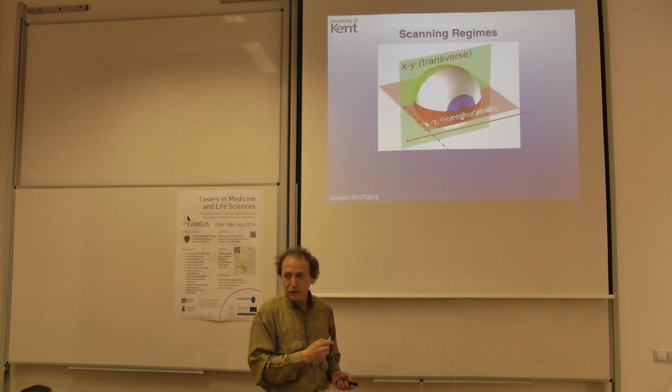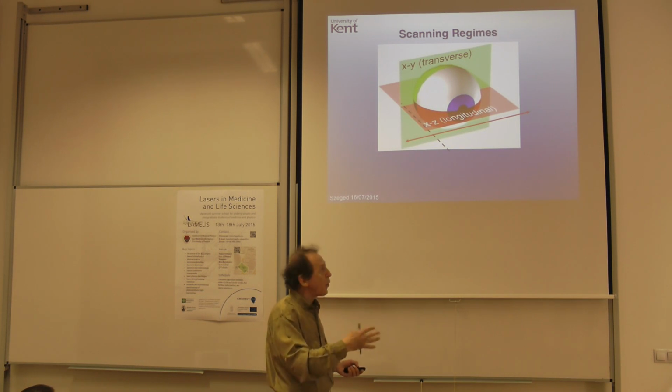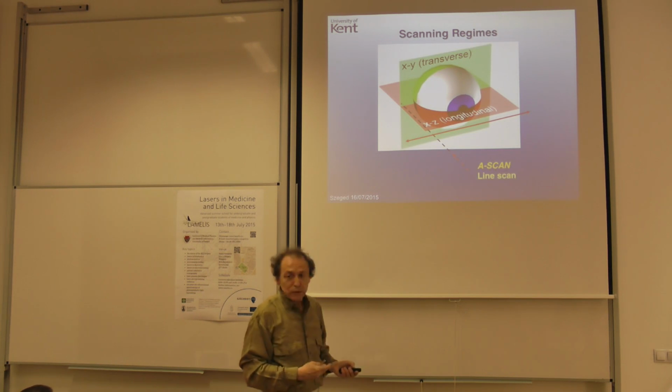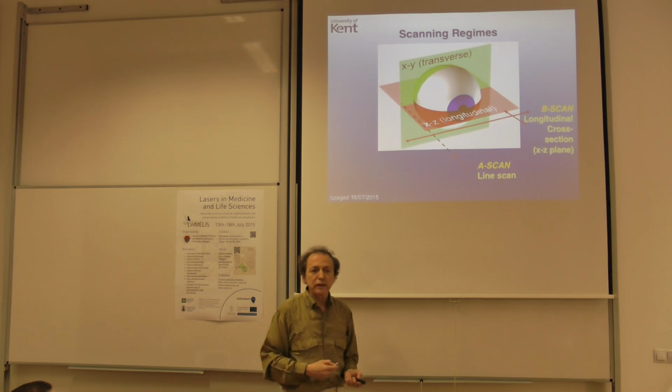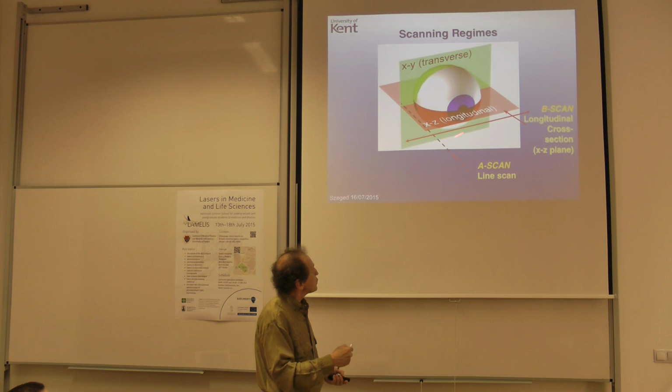Let's go more. Now we start with OCT. OCT has been invented by adding technical ways to move the beam laterally and do the interference which I presented before. How do you do that? There are different possibilities. If you put the spot here, you do the analysis by moving that reference mirror in the interferometer and you get a reflectivity profile in depth, which is called, like in ultrasound, an A-scan. If you do many of these together, you produce what is called a B-scan, and that's the way the technology started and evolved for more than 10 years. This is called a B-scan, a cross-section.